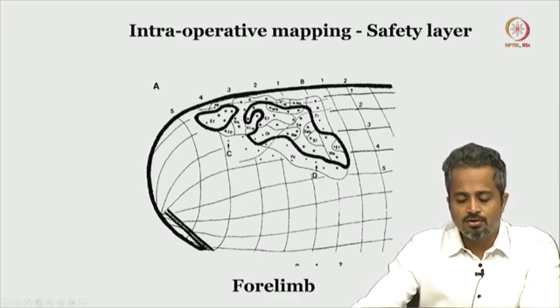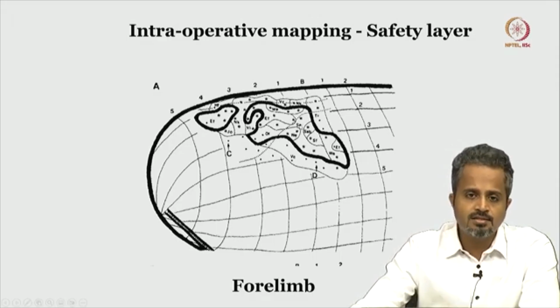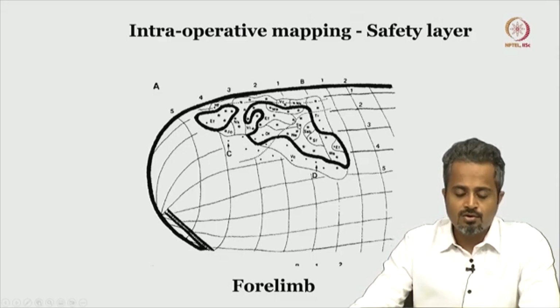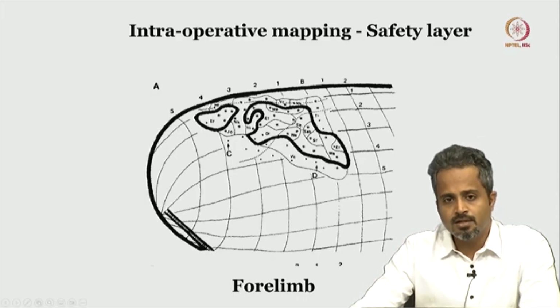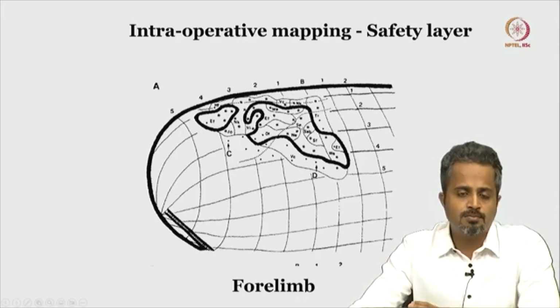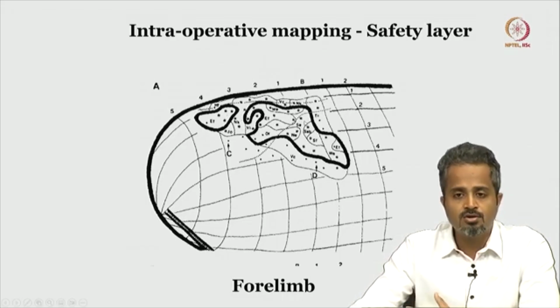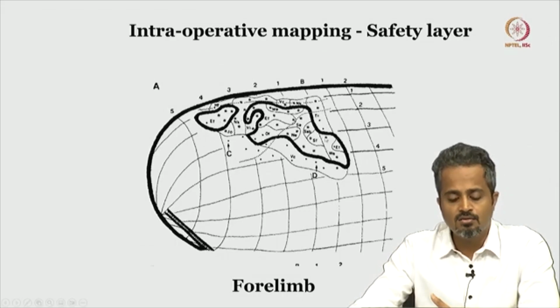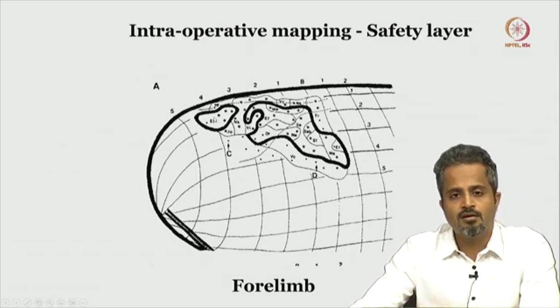You implant your probe, microelectrode, be it a tungsten electrode or any specialized neural probes, in this area and then stimulate it with certain parameters. You will see motor evoked responses. Based on those responses, you know where you are. For example, if the proximal joints are moving and not the distal, you definitely know that you are dealing with the rostral forelimb area. Similarly, the caudal forelimb area.